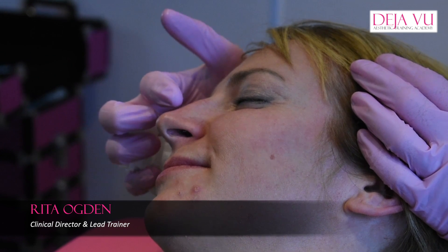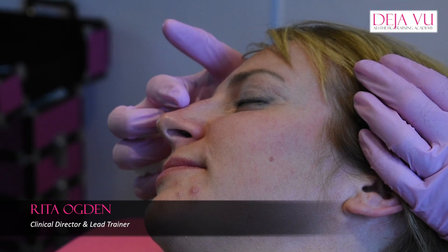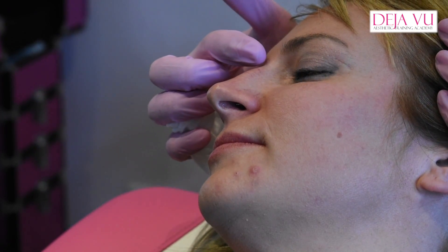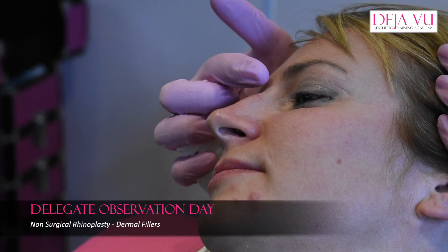So, what I'm going to do is first fill in this little bit here. Remember, be careful, go slow — you've got all your facial arteries there. I may need to, because it is slightly bumpy just there as well, just soften that as well.